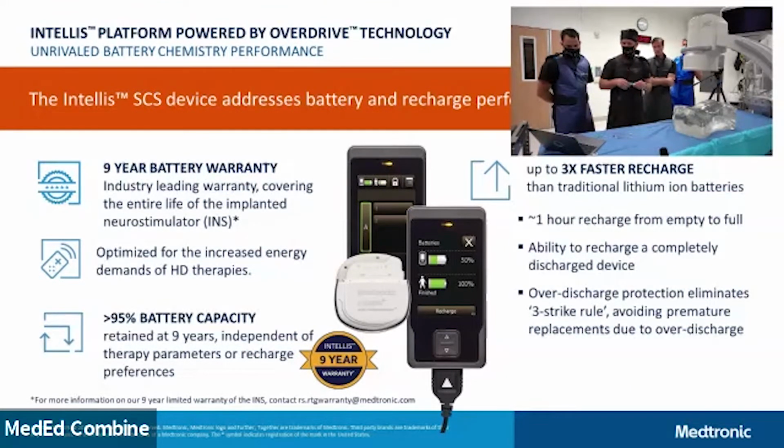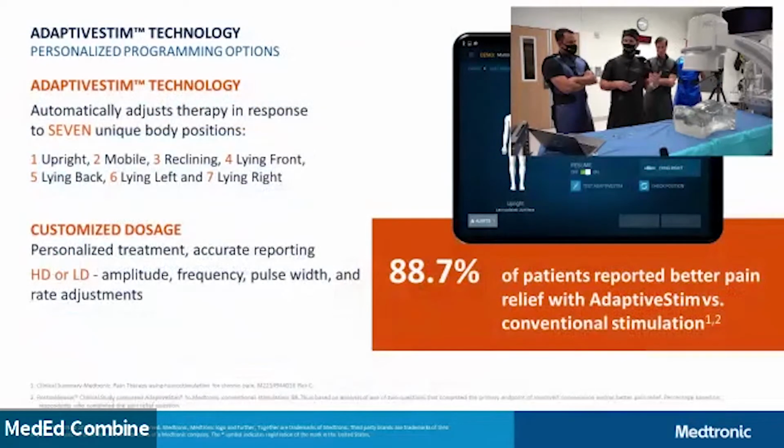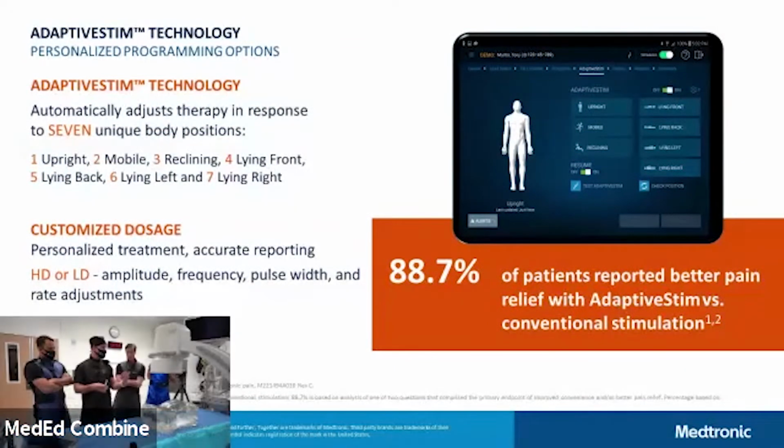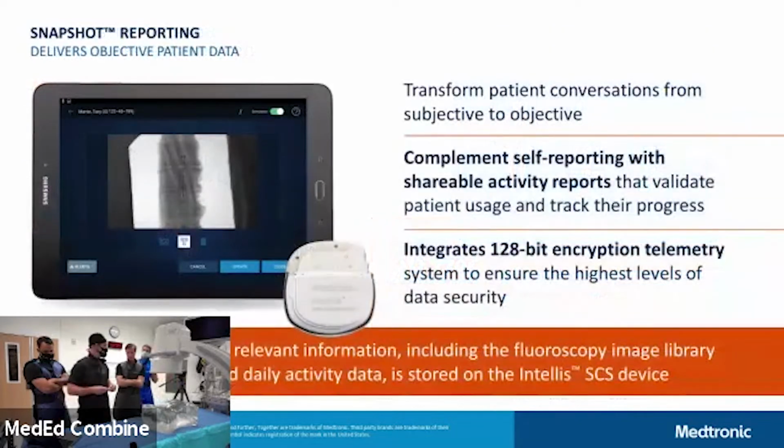So when it comes to the ability to program this, I've always feared that a rep would go into a room and be like, I know what I need to do, but I don't have the tools to do it, right? Mm-hmm. So one of the things we can talk about is this slide right here. Tell us about the DTM, Tommy.